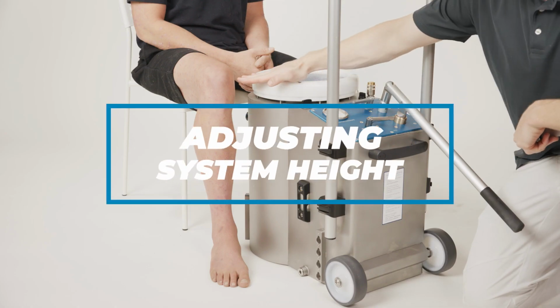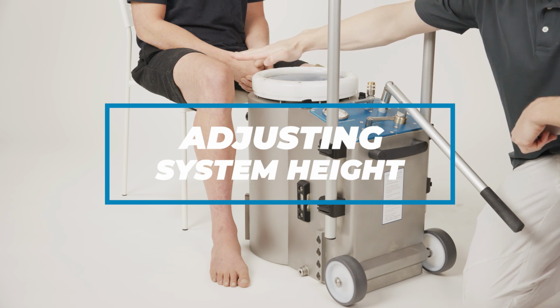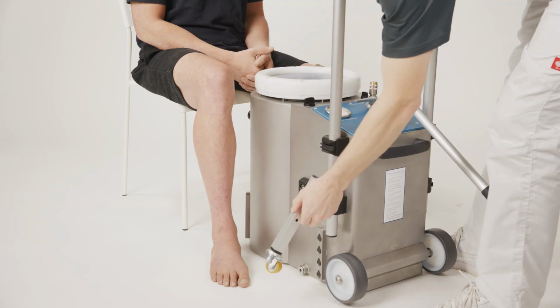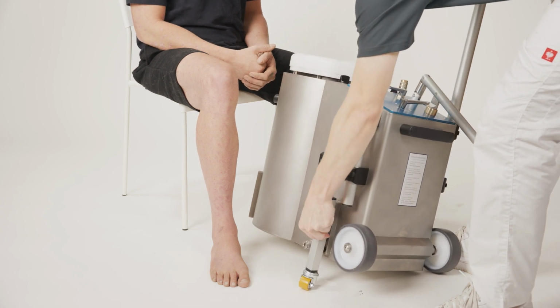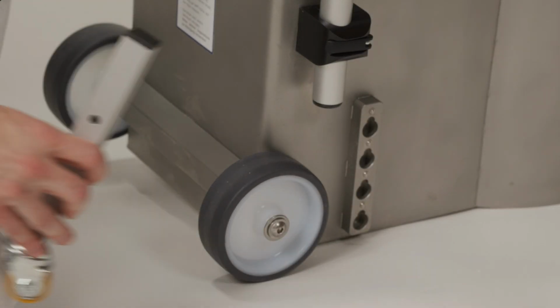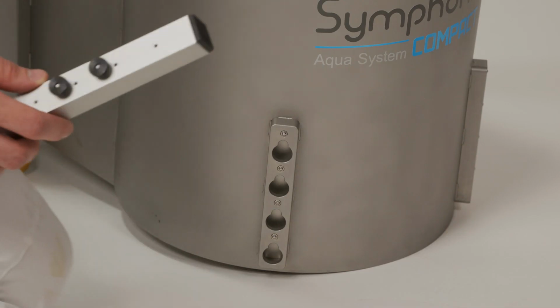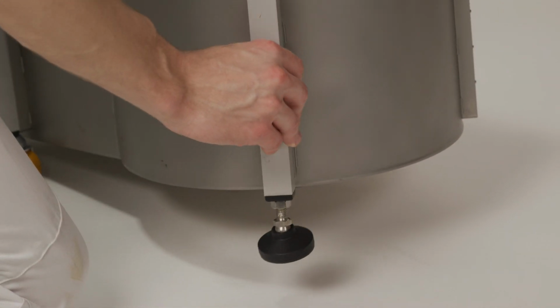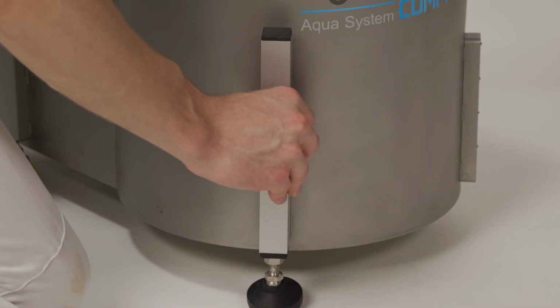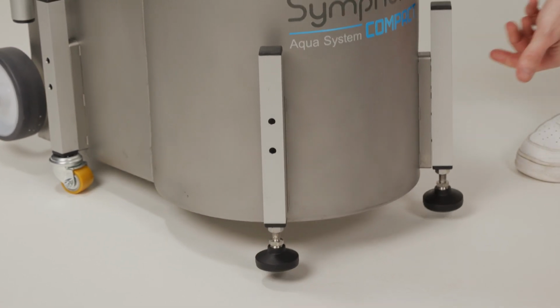In order to make the patient's impression procedure as comfortable as possible, you can adjust the height of the system. An indication for the optimal height is the upper side of the thigh while the leg is bent at 90 degrees. The levelers can be easily mounted by one-sided tipping. The castor wheels must be mounted on the side of the gauge panel. Consequently, the system can be more easily positioned during the impression procedure.